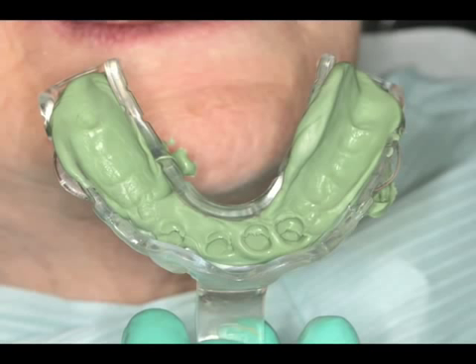Take a look at the posterior part of the tray where there are no teeth, the edentulous ridge. You can see a nice little curvature here. We'll just trim the excess off, but we'll actually leave this for our posterior stop. In the anterior section, you'll see the 4 little impressions of the top of the impression copings. Now this particular area, we need to shave it down until there is no axial height of this prep. In other words, we should only have the occlusal or incisal portion that will actually touch up against the tray.